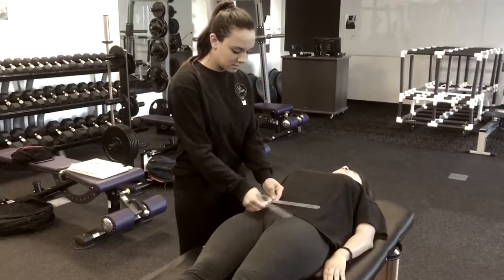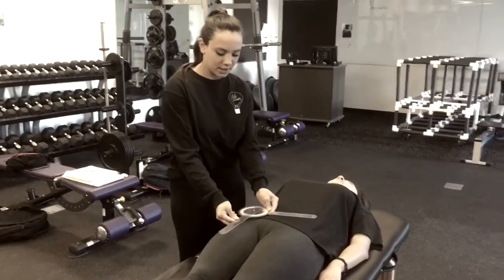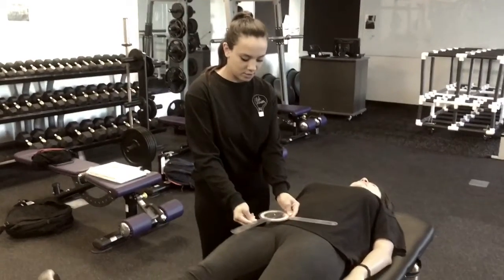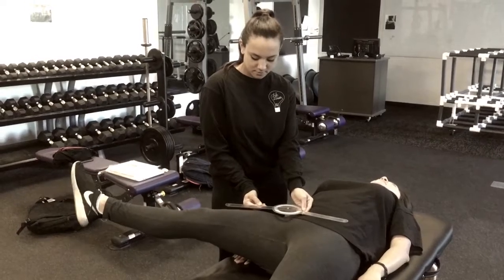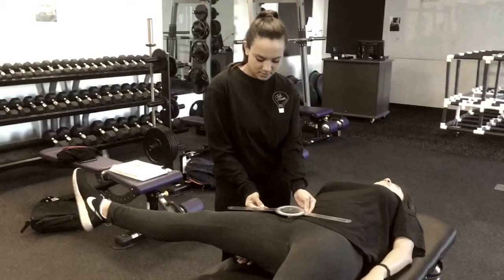Hip abduction range of motion. Hip abduction range of motion is tested with the client laying supine on the mat table with both legs extended in neutral position. Have the client abduct their lower leg. The axis of rotation is over the anterior superior iliac spine.